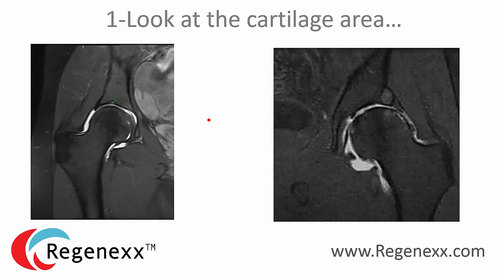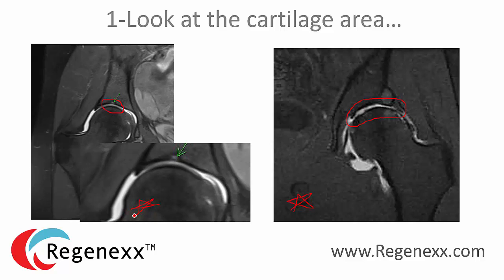This particular patient has less cartilage — less gray stuff — in this area, and this patient has no gray stuff at all. So this patient over here has severe arthritis, and this patient over here has more moderate arthritis. If we blow that up, you can see that in this particular area there's less gray stuff, meaning less cartilage.